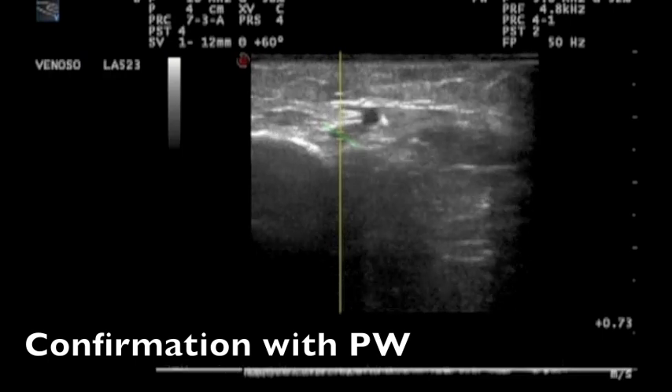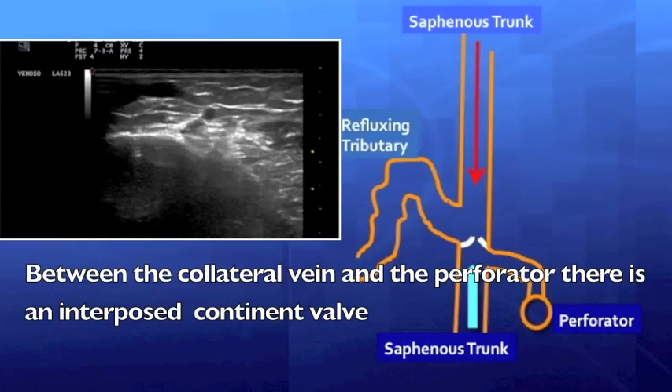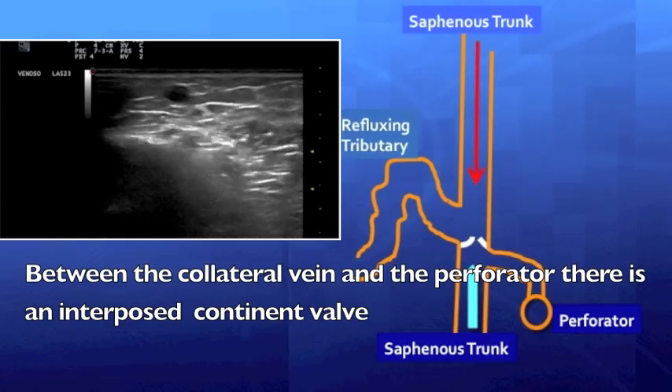This hemodynamic behavior, which doesn't match with a terminal re-entry perforator, suggests the presence of an interposed competent valve.